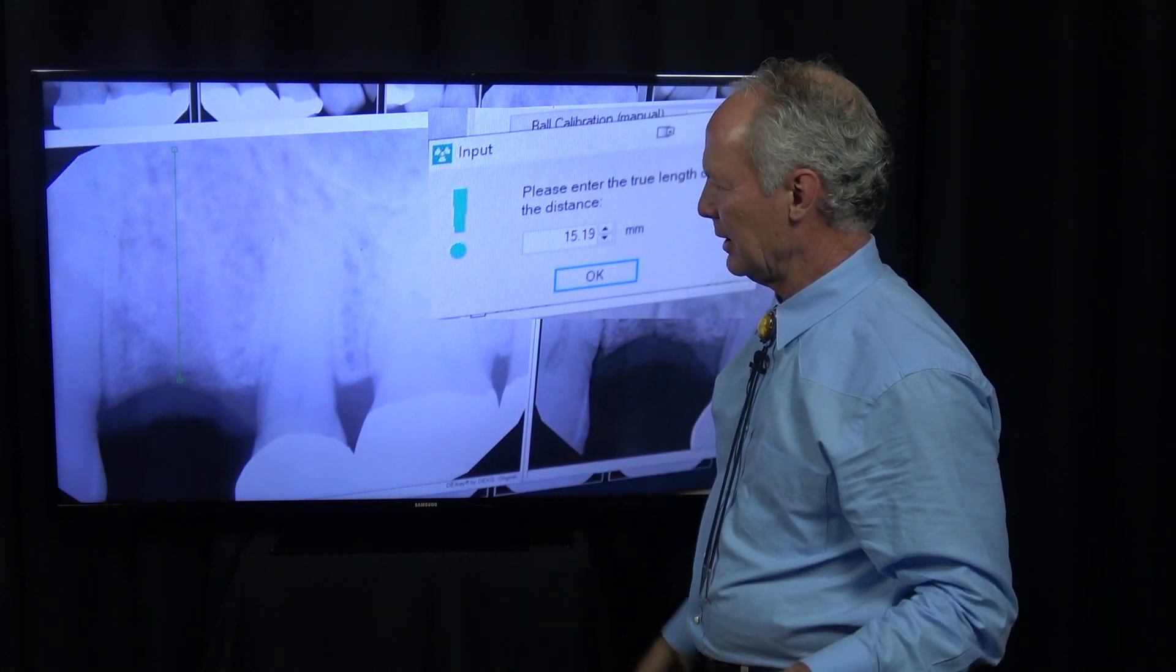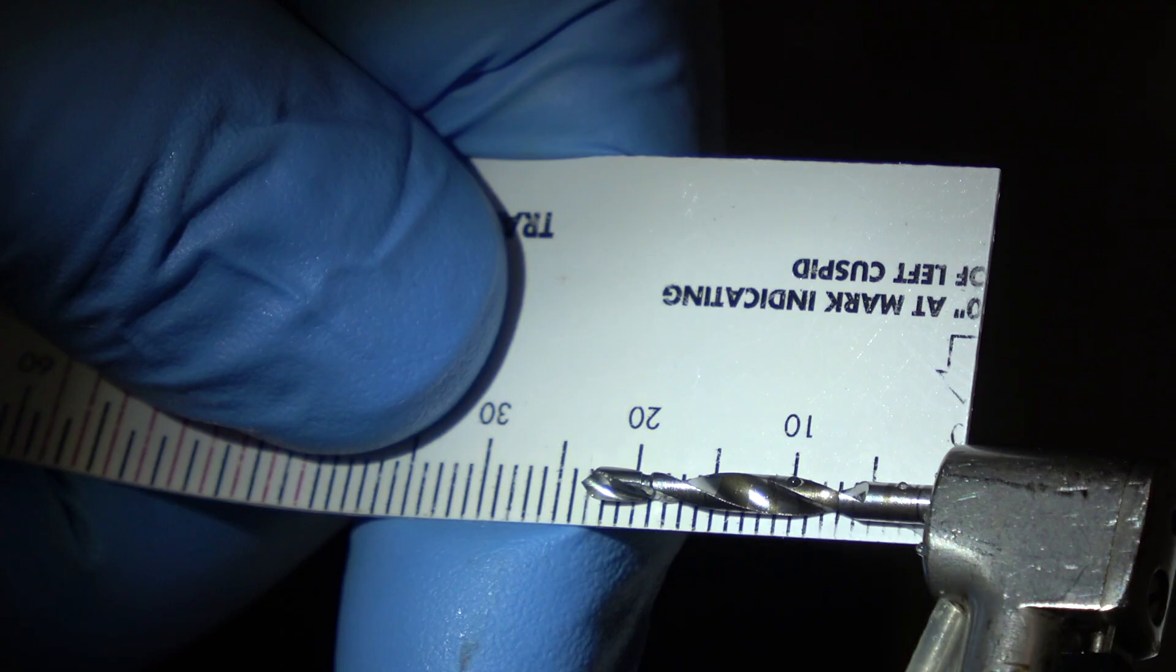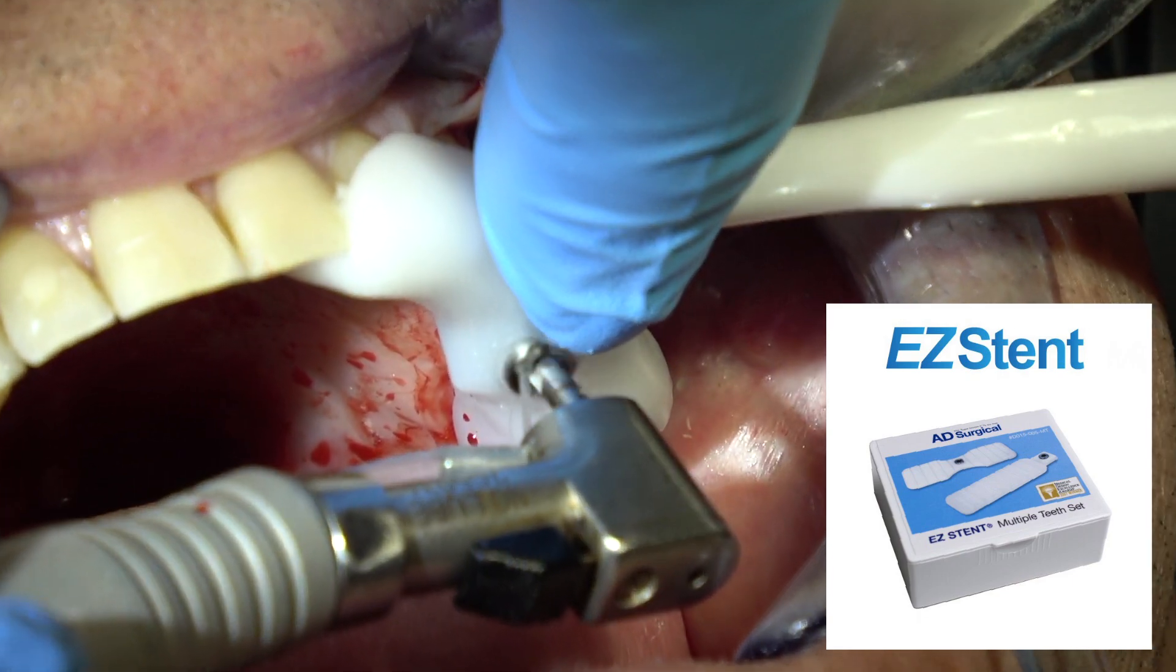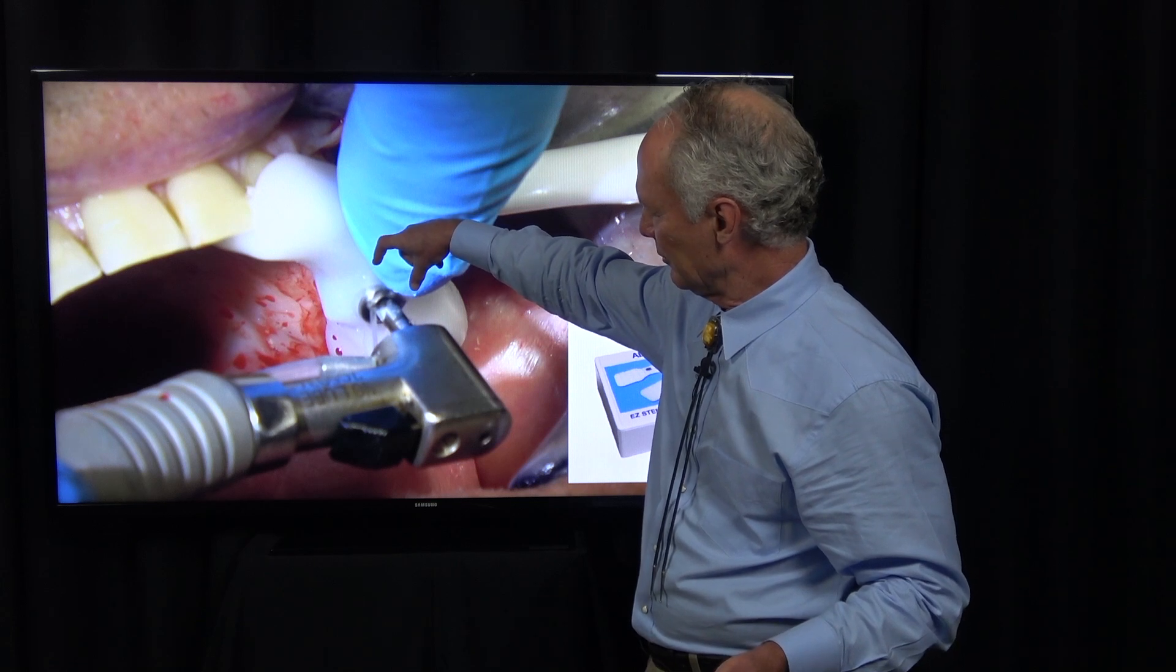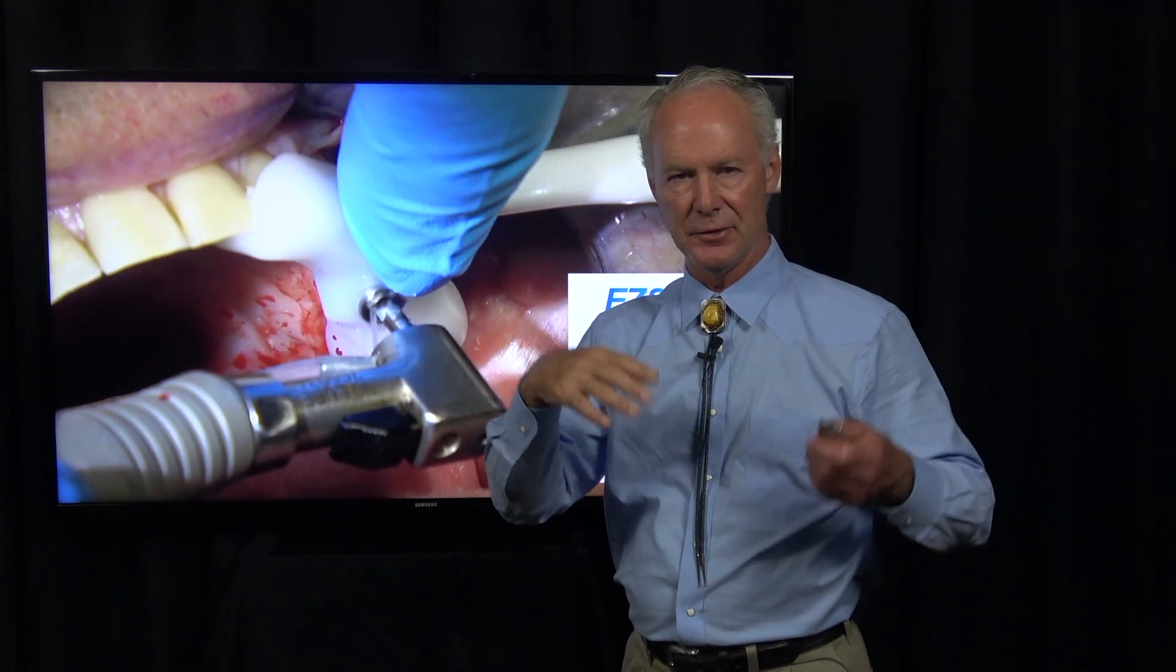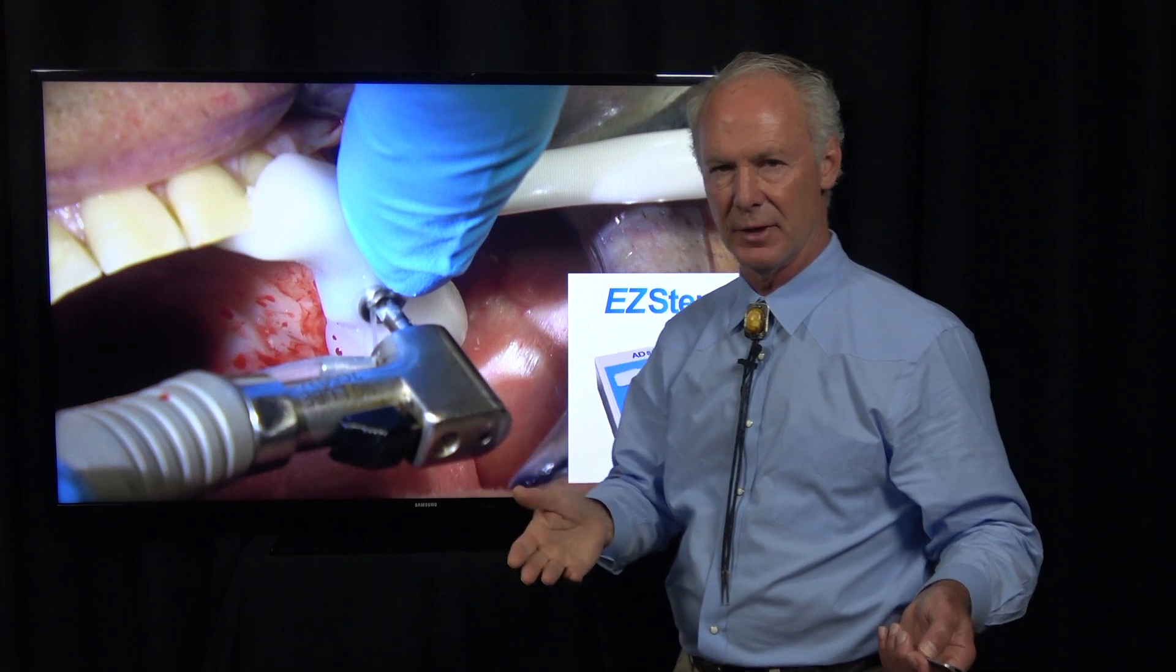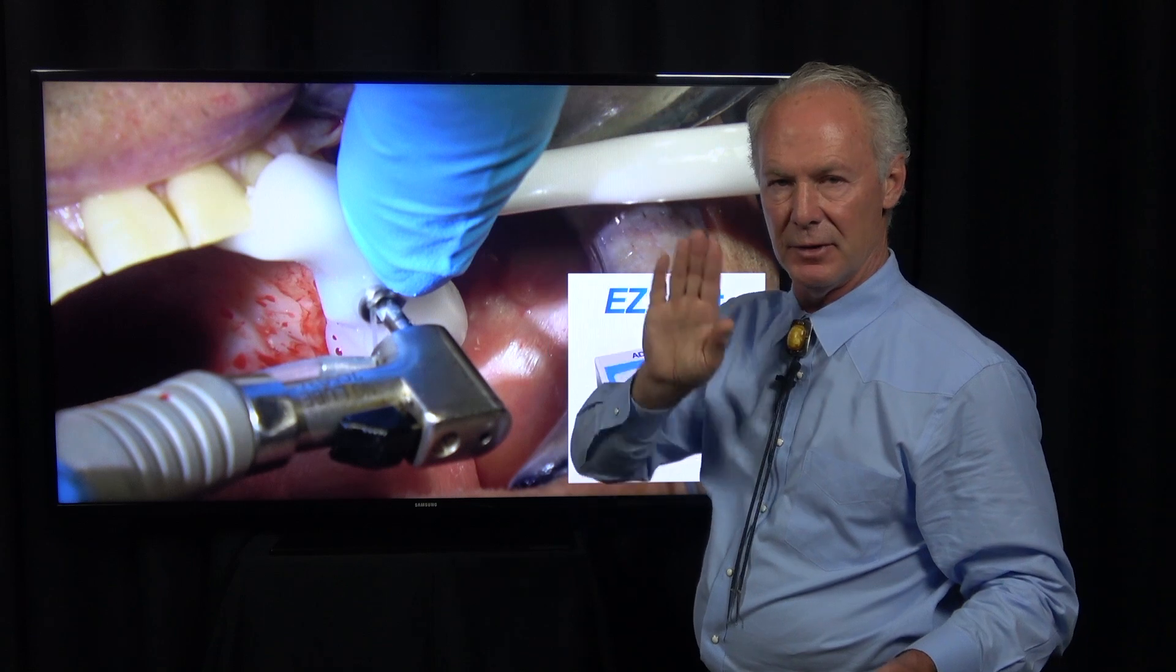The longest implant I'm using is 14 millimeters with the Dentist system, so there's plenty of room. That measured over 20 because I factored in the vertical height of the stent. It's not a problem if you drill a little too far, as long as you're not drilling into anything you don't want to. That's what the radiograph is for—to see what's up there because you don't want to drill into the nasal cavity.